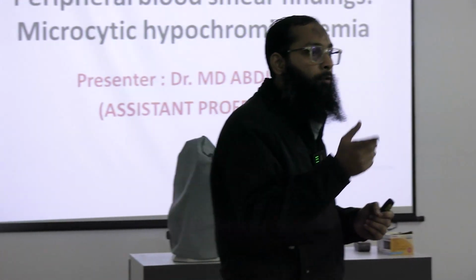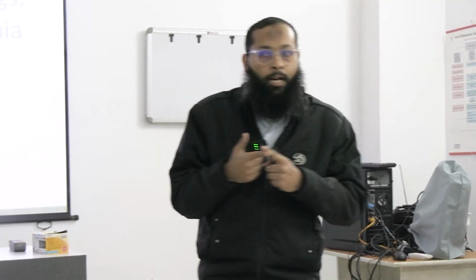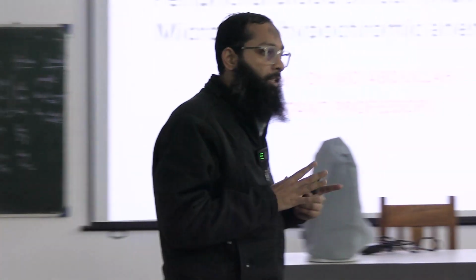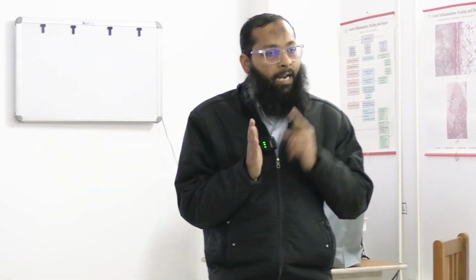If you are going to report a patient, you are using a patient blood sample and you are going to report based on that slide, identity is very important. Otherwise, you will make a major mistake. So, next step, can you continue? You have made an ID on that slide. Maybe you can write the patient name in short or your name.